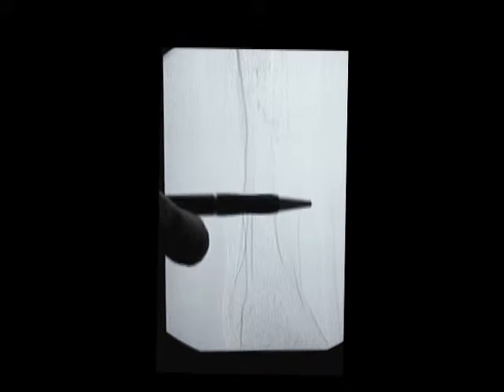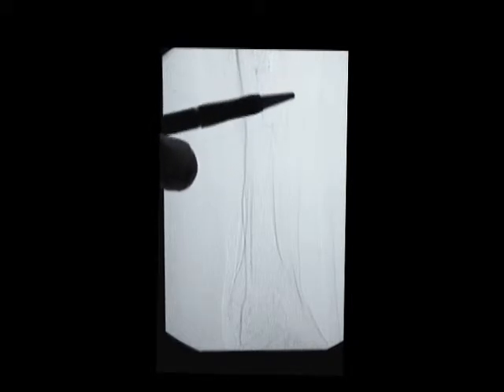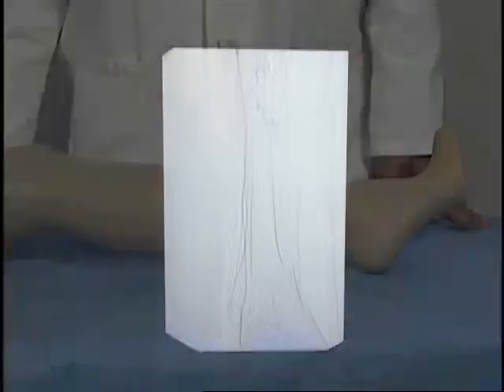Therefore, in considering the injection plan for this patient, attention would be paid primarily to a medial-based injection along the plane between the posterior tibial and the peroneal artery. This plane would be extended across the ankle over the foot to the area of ischemia on the great toe.